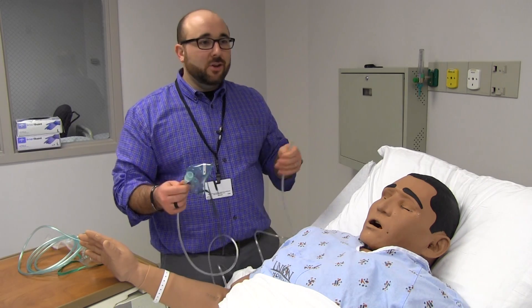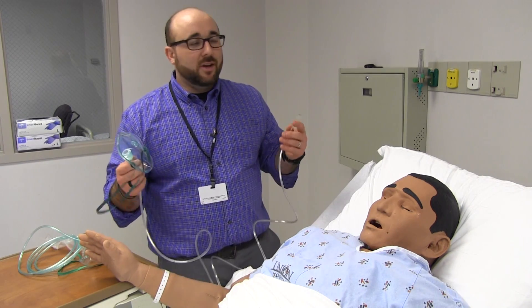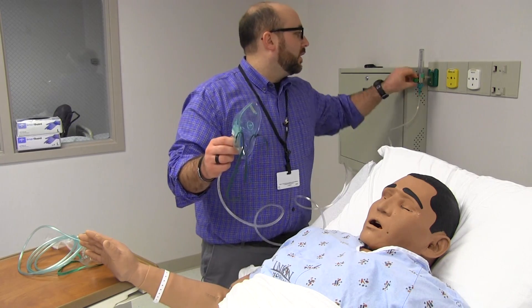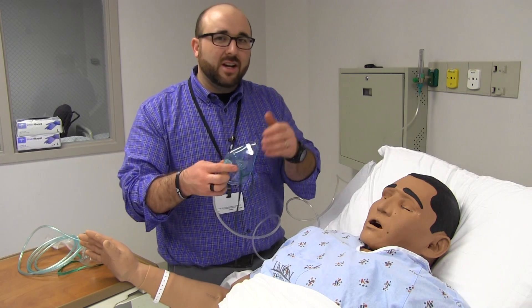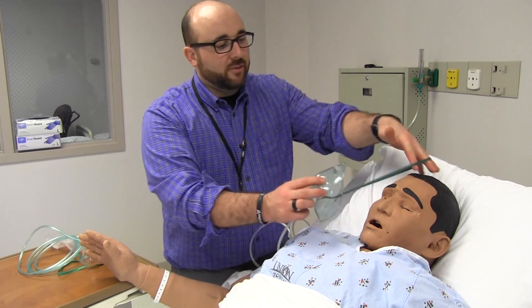Generically, you can put a low flow of oxygen on this if you want, but usually it's recommended to go anywhere from 8 to 10 liters. I'll plug this in and go to 8 liters — you can hear it running. This is what you'll see in some of those other areas, just delivering oxygen. The patients aren't necessarily critical, but we're just going to deliver oxygen.